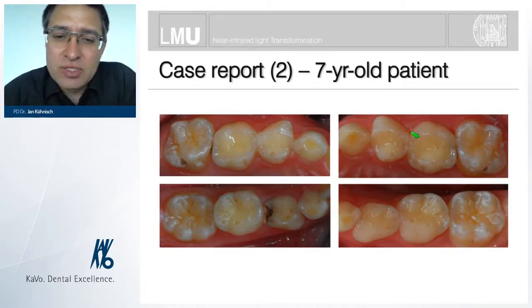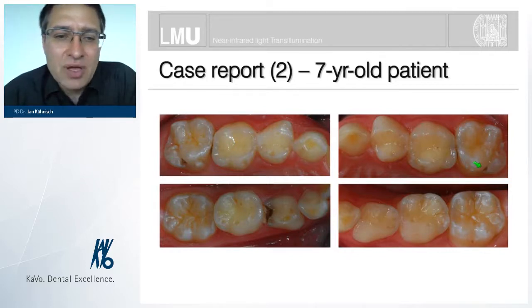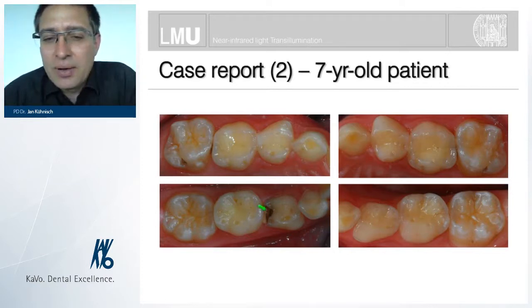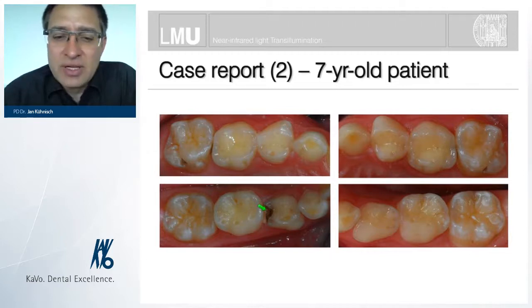The patient, this was from the first appearance, had a cavity in the lower arc, and an interesting finding was these enlarged pits on the palatal sides, which were configured by nature in this way. But of course, if I'm seeing a cavity at this age in such patients, there's definitely an urgent need for additional diagnostic tools, and it means that we need to investigate this child furthermore.